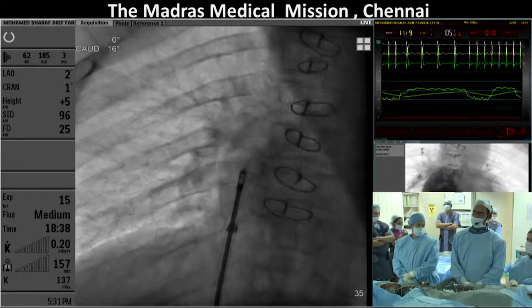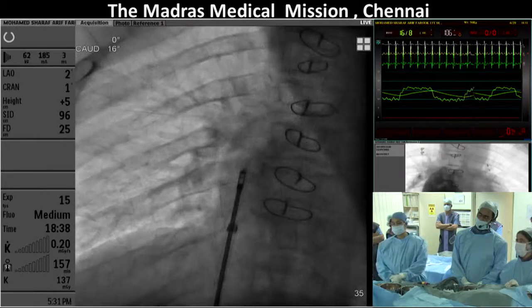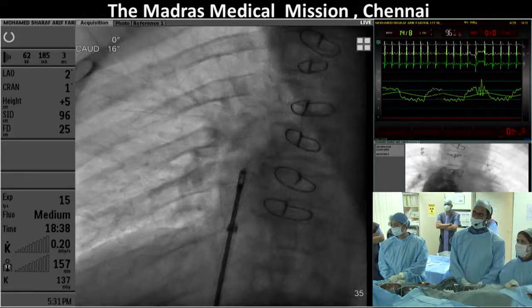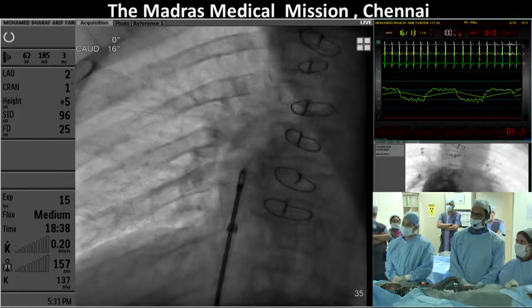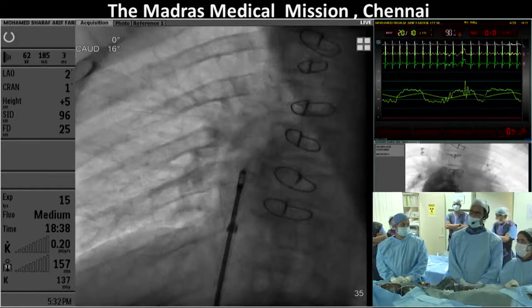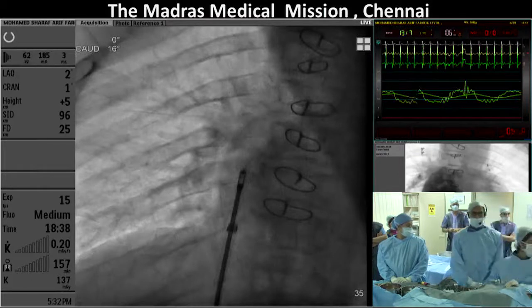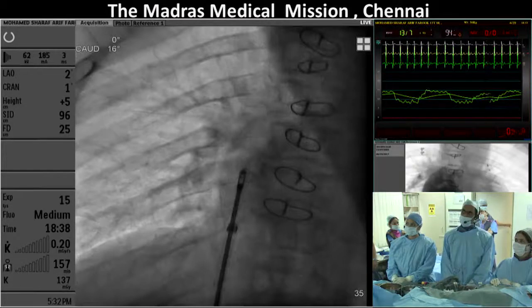And the reason it's an active phase is that you will get deposition of fibrin platelets around this device, which will progressively decrease the size in a semi-predictable way. I'm not surprised that the baffle pressure didn't go up, because the differences between too big and too small a hole are really quite small in this condition. Yeah. And I don't know that any of us here know what this baffle pressure will be a month from now or 6 months from now. But I don't think it'll be 13. I think it'll be higher than 13.